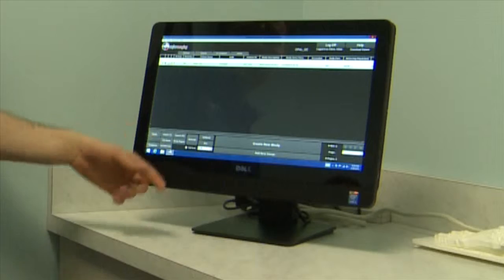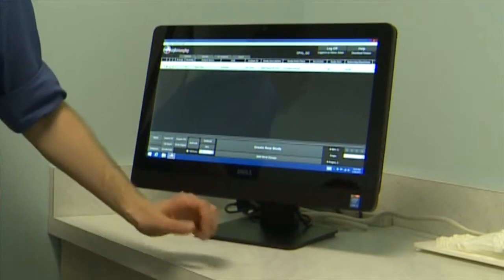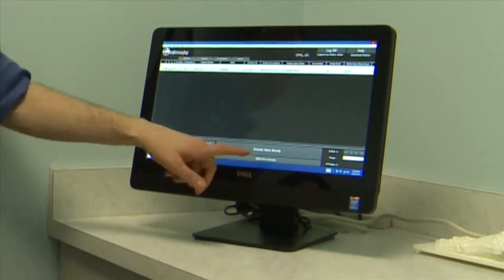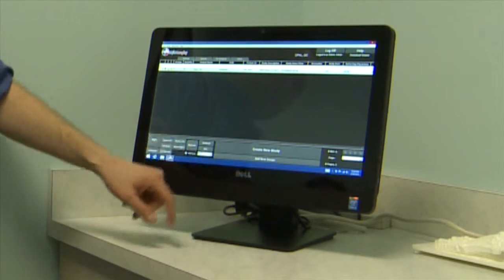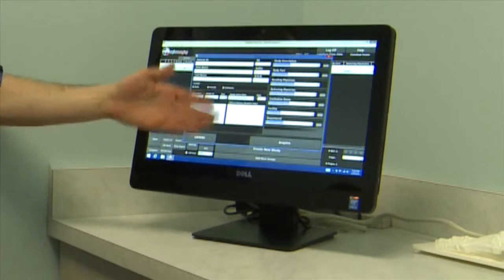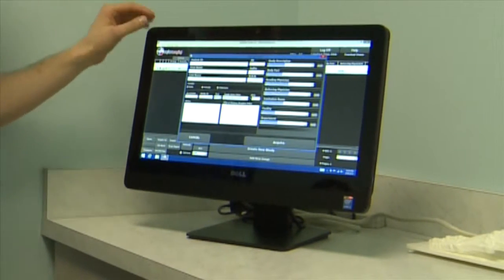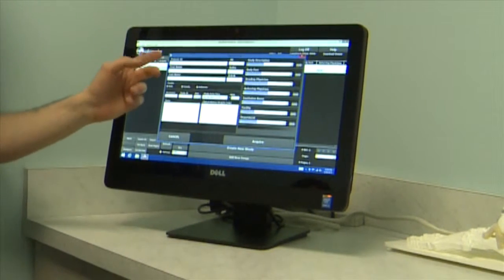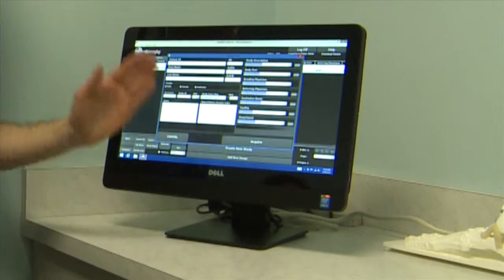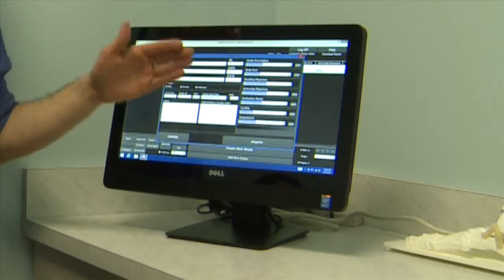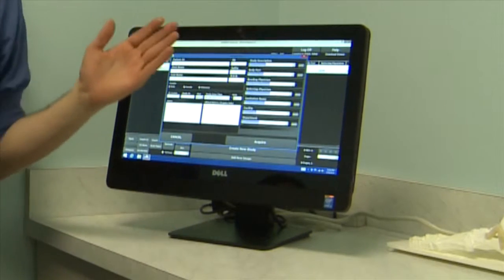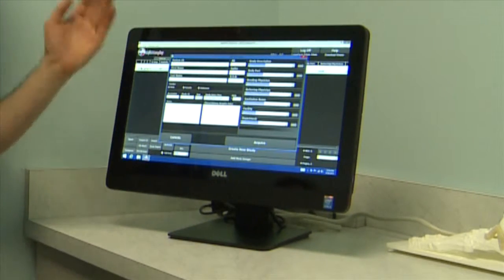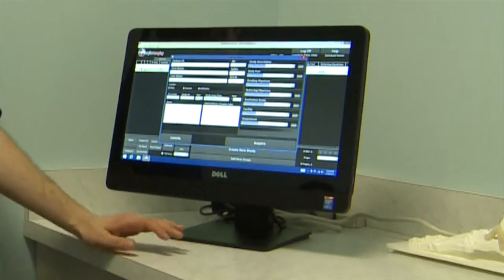Once you've logged in and a patient is coming in to take an x-ray, simply hit the Create New Study button near the bottom. That'll bring up your patient demographic screen. It always starts with patient ID — if the patient's already in the system, it will automatically find their information once you put that ID in and move to the next field.